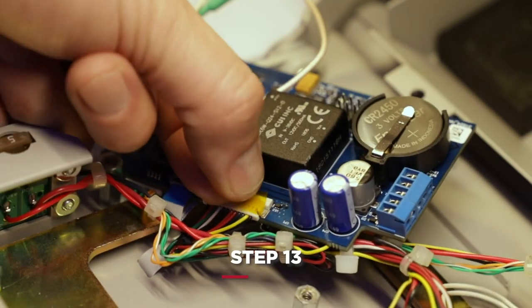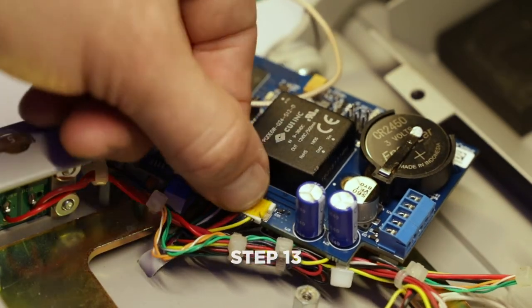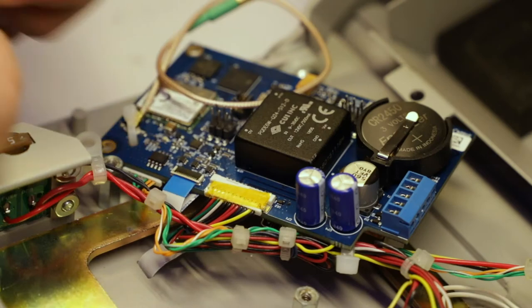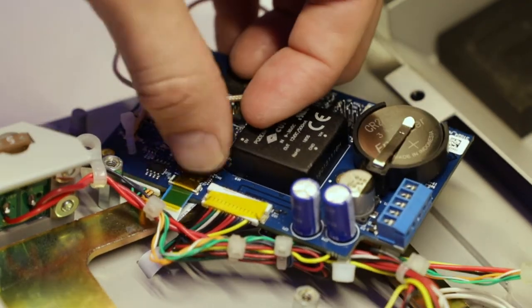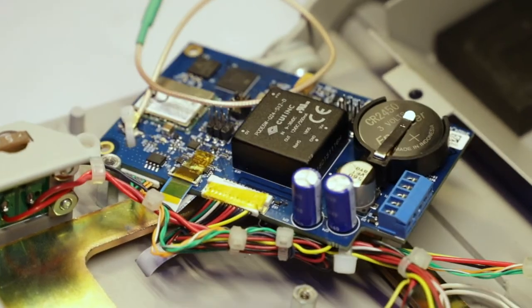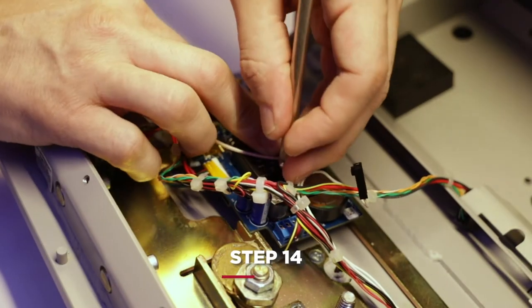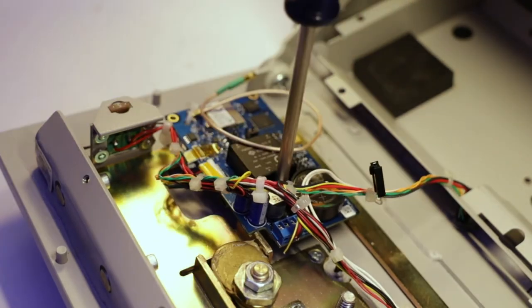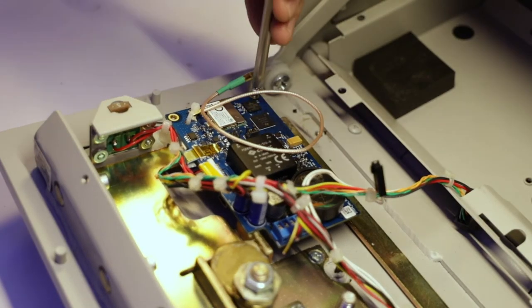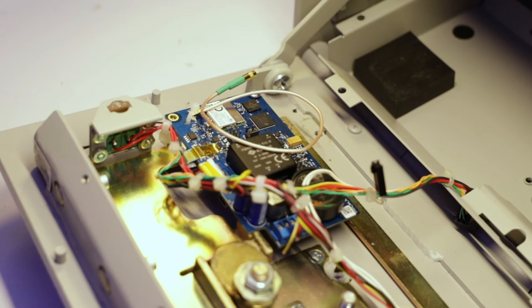Now you are ready to apply Kapton tape to the keypad display connection and the IO connection. Kapton tape is included in the retrofit kit. Fasten the circuit board in place, using the original Medvault screws for two of the locations. For the third location near the terminal block, use a screw that is included in the retrofit kit.